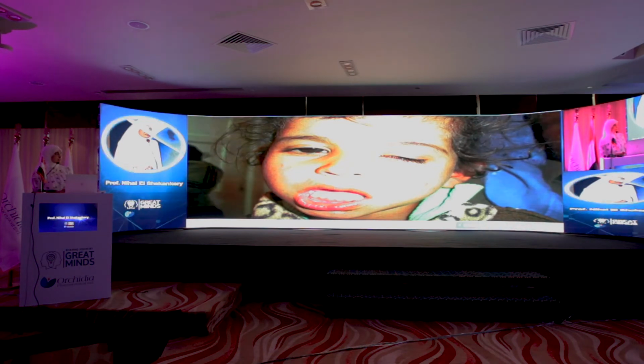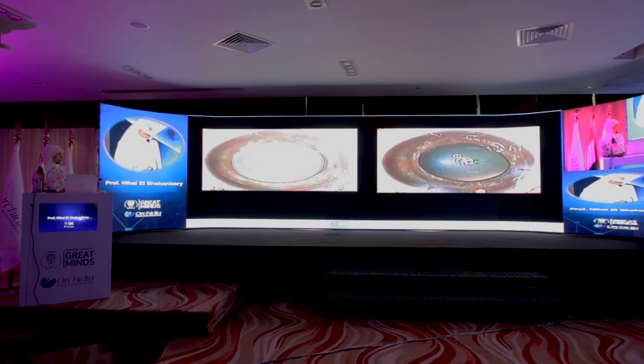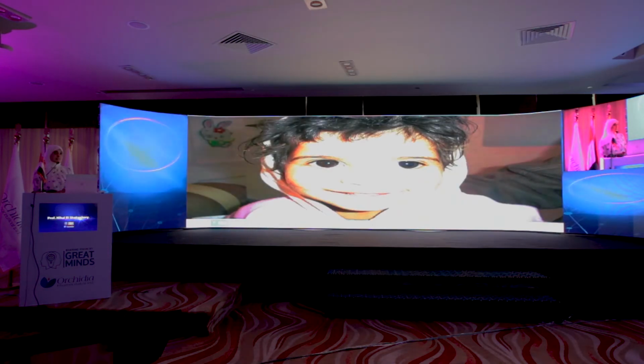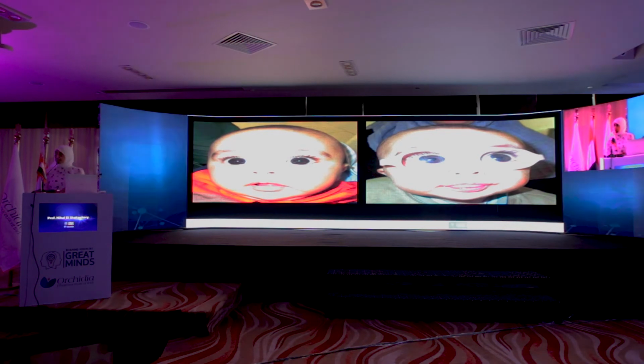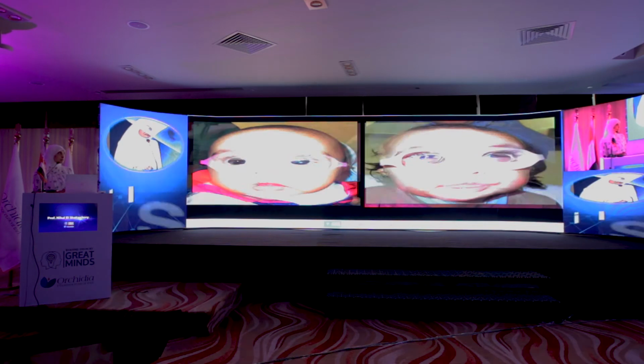Finally, this is an example of a child with a long-standing pupillary block glaucoma, here before and at the start of surgery and at conclusion of surgery, immediately after surgery, and here before and few months after surgery. Vision was preserved in the right eye and glaucoma was controlled in the left eye. And of course, we had to go for screening of the other sibling. We diagnosed her brother as having microspherophakia, and it was possible to perform lensectomy and preserve the eye and preserve vision and prevent other complications.